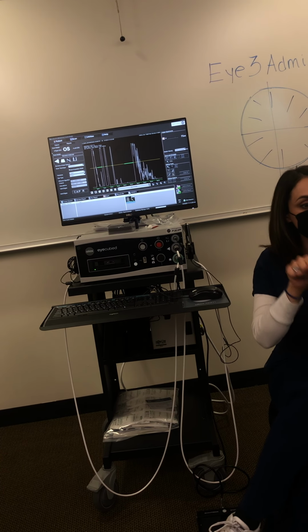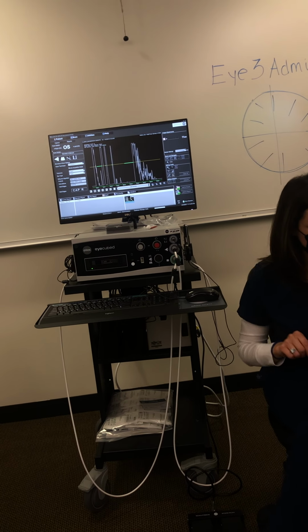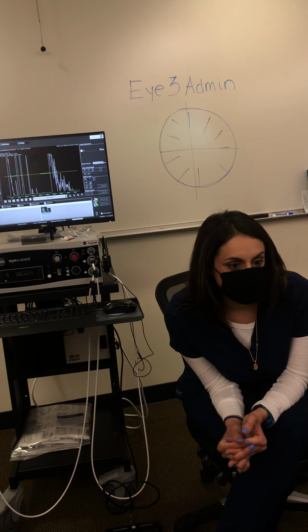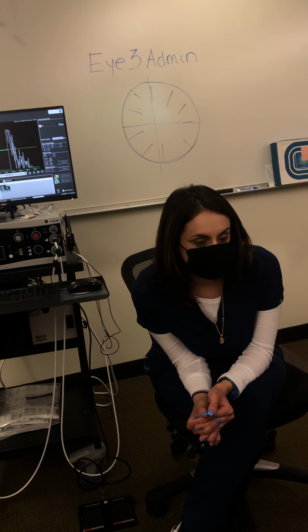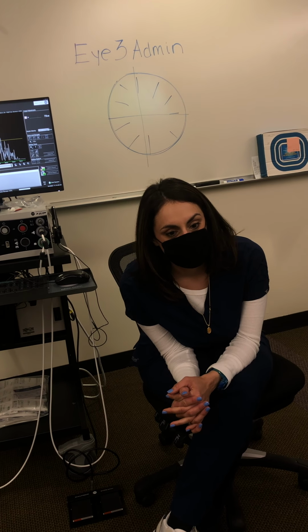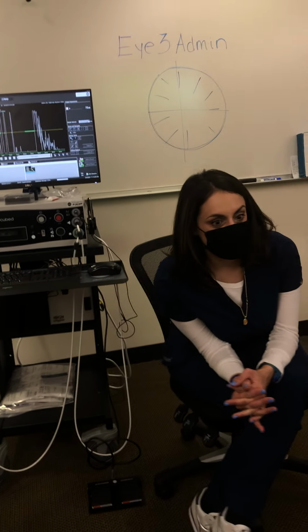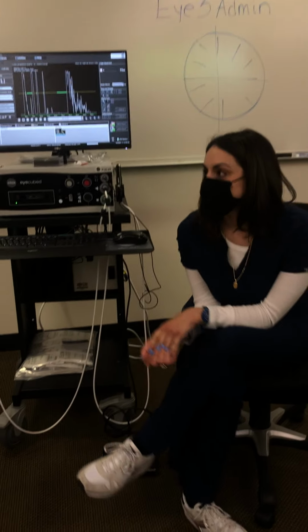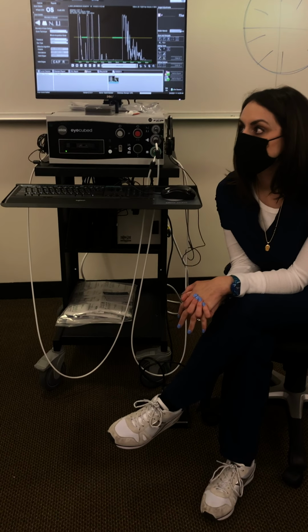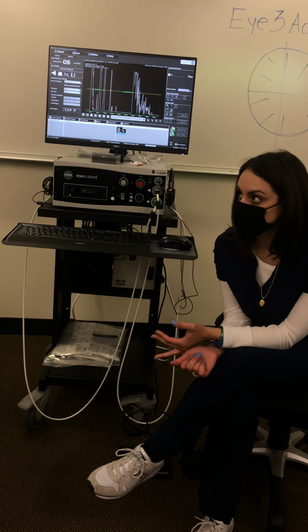It goes around the limbus, and you feel the pressure. I let other people do it on my eyes, and you can feel it because they have to rest their hand on your cheek and press so that when you squeeze, the liquid isn't coming out. It's a balance. I think you want to tell your patient, we've anesthetized your eye. You won't feel pain, but you will feel pressure. They'll also feel the cold water coming in. That's the part that gets people panicky. The more you tell your patient, the more mentally prepared they are for what they're feeling.